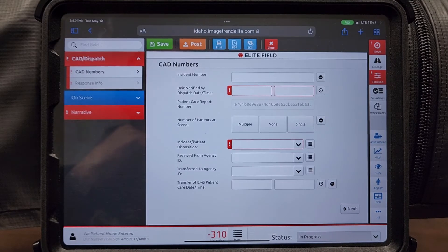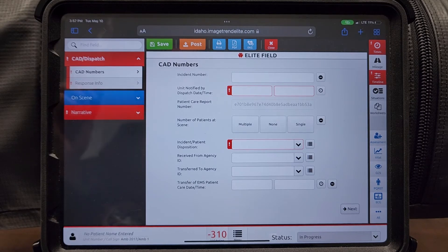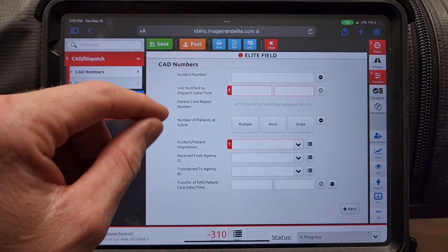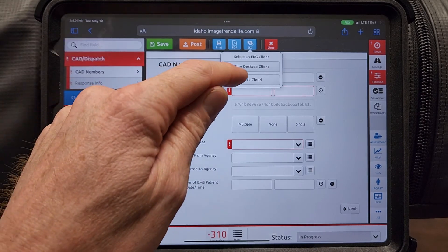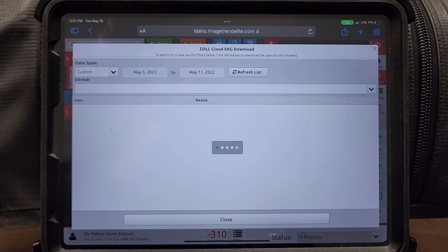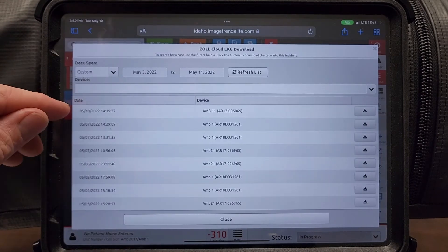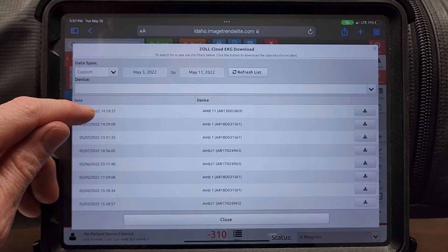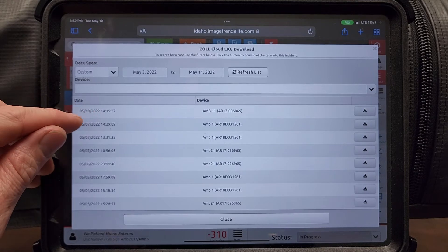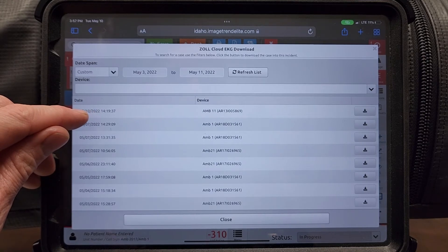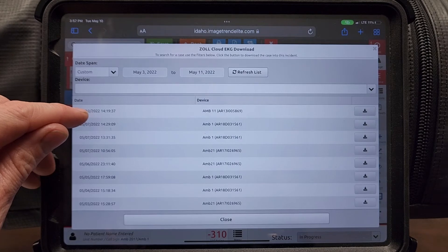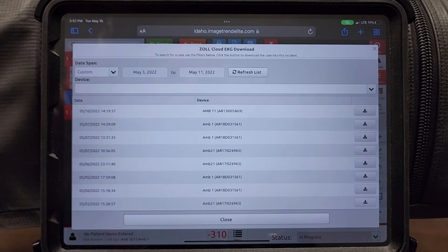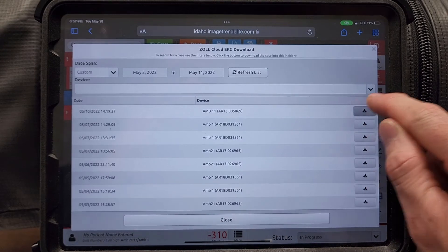Now we'll show you how to download your vital signs onto your chart. To download vital signs, you're going to come up to your charting software and hit the EKG button and select Zoll Cloud. This list of available cases are the available vital signs that you can download. The timestamp correlates to the time and date that the monitor was turned on when you arrived at your patient. Select your appropriate patient and hit download.